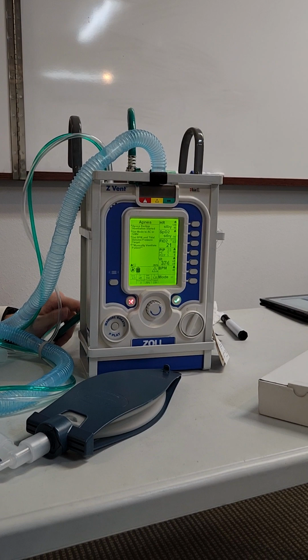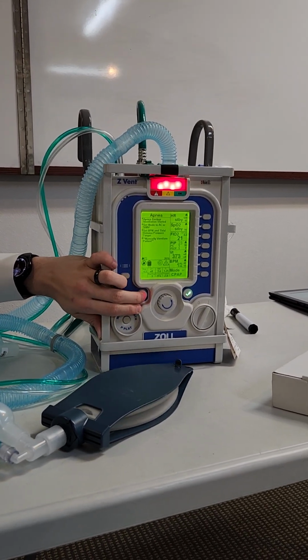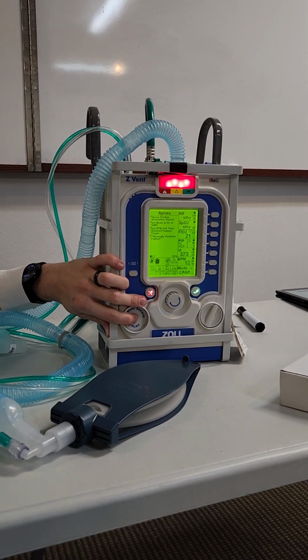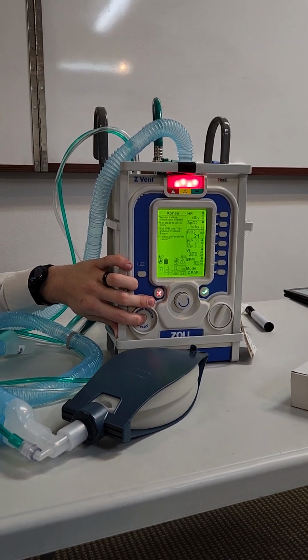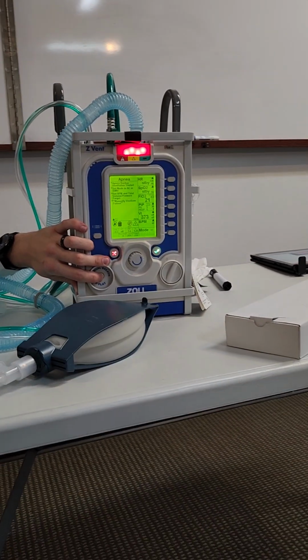So the machine is breathing now. Yep. Okay. And then it'll holler at you and tell you that you need to fix whatever is making us go into the backup. Yep. Either change your settings and intubate this patient, or do something different, because they are not breathing.